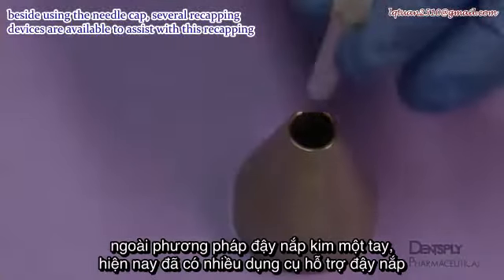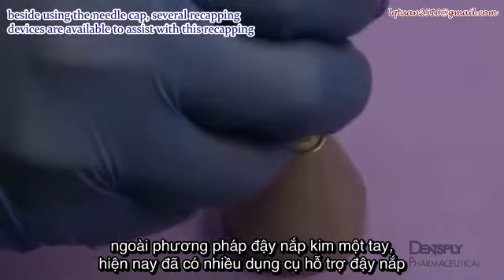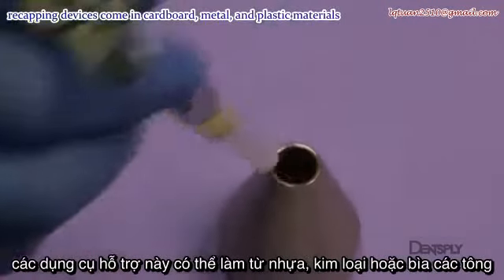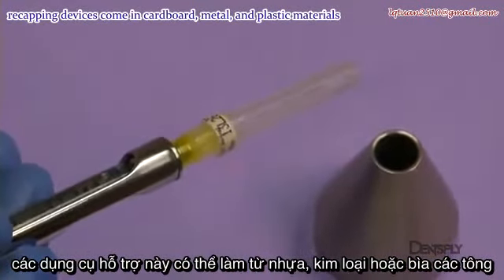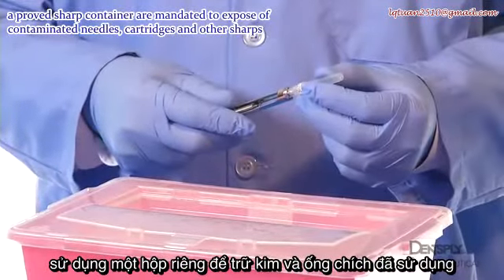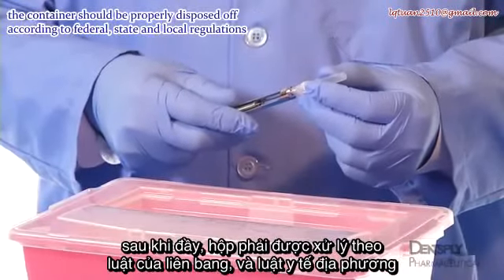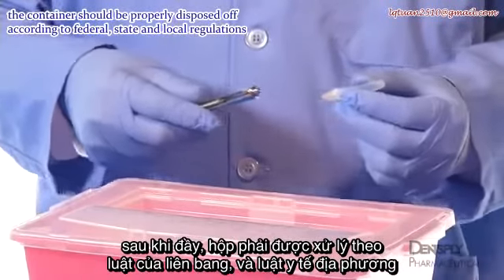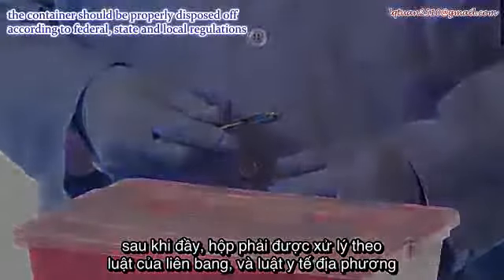Besides using the needle cap, several recapping devices are available to assist with this recapping. Recapping devices come in cardboard, metal, and plastic materials. Approved sharps containers are mandated to dispose of contaminated needles, cartridges, and other sharps. The containers should be properly disposed of according to federal, state, and local regulations.